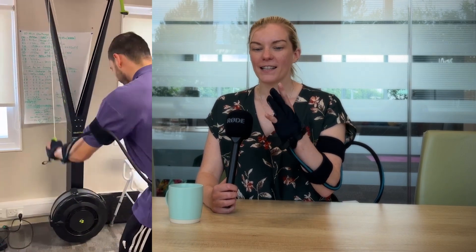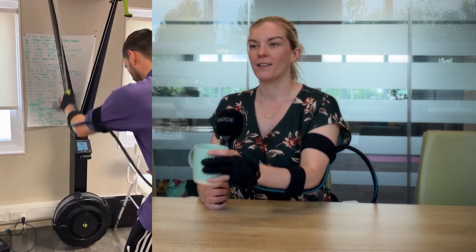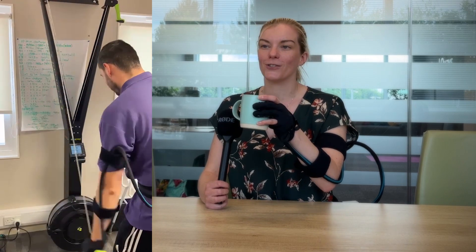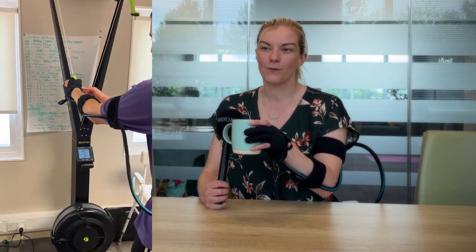Clinicians in rehab settings are integrating the Carbon Hand with other functional arm exercises, making them more applicable to daily life. For example, if you're working on arm raises with a cable machine or pulleys, it can be tricky to understand their purpose without functional hand use. But if you add a pulley grip or ask someone to grip a cap, the movement becomes far more functional and motivating.